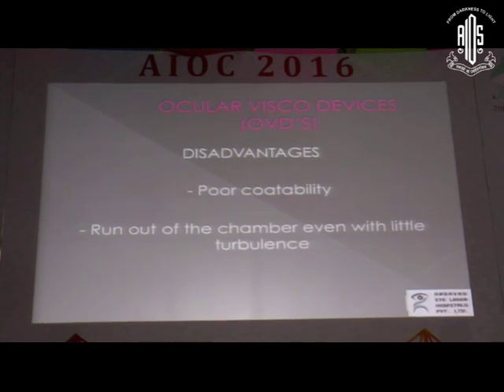But the disadvantages are that it has got very poor coatability, like I showed you in the animation. So they come out of the chamber even with the slightest of turbulence, and you can understand the moment your phacoprobe goes and irrigation starts, the viscoelastic starts running away.